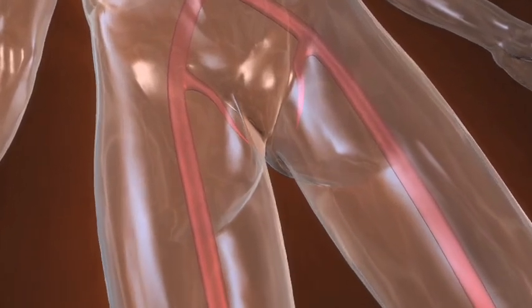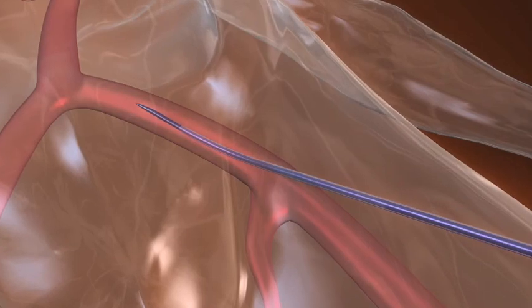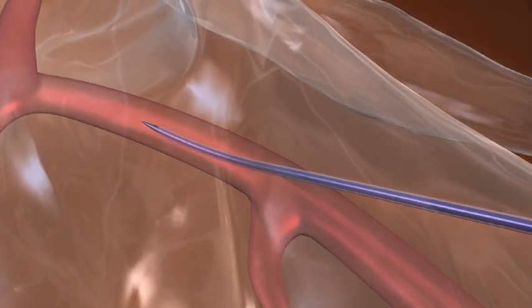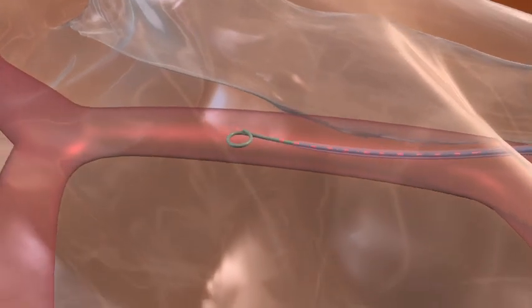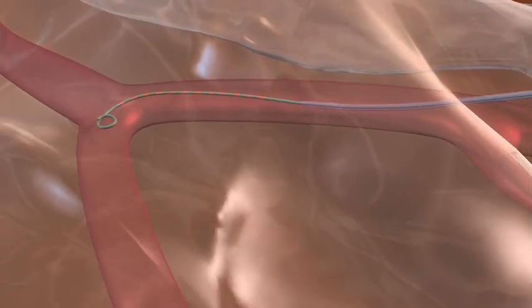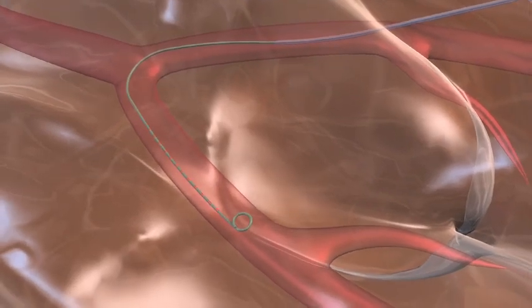Prep both the patient's groin areas. Insert a 5 or 6 French introducer sheath into the contralateral femoral artery. Insert a graduated pigtail catheter through the introducer sheath and advance over a guide wire to the primary femoral artery.